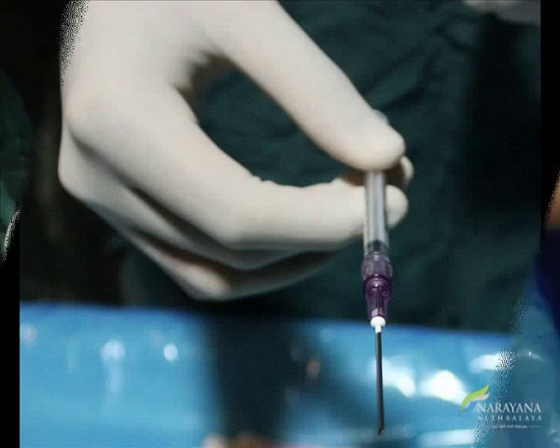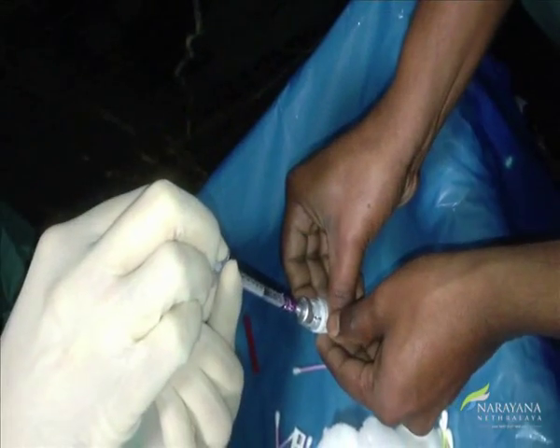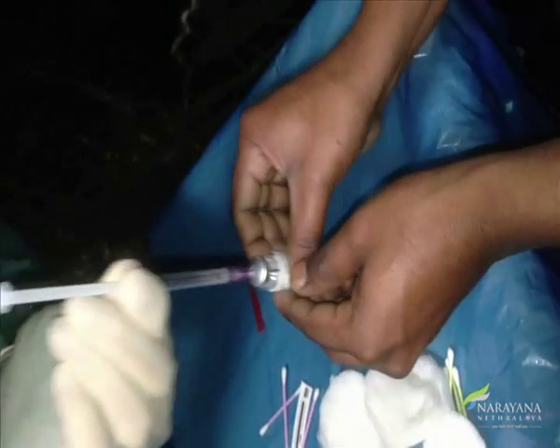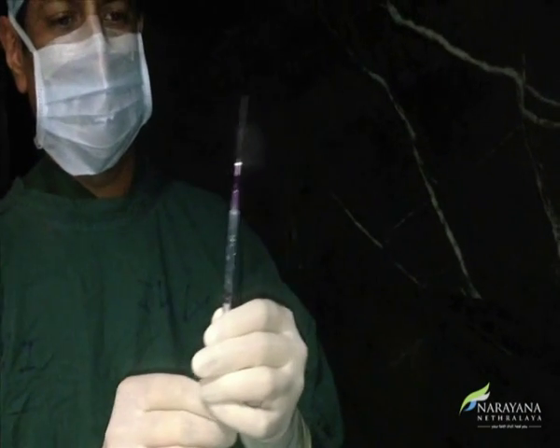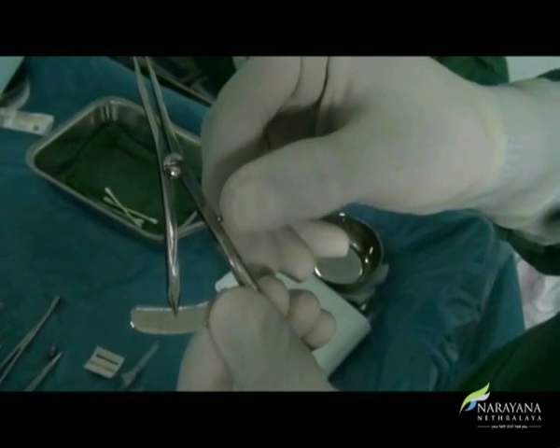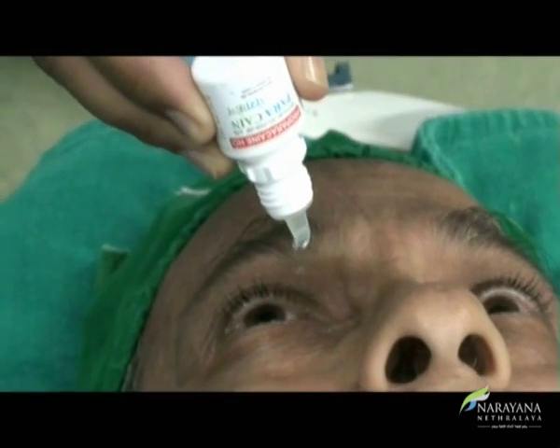In the case of Lucentis, a large-pore needle provided with the vial is placed on the syringe and the drug is aspirated, keeping the needle vertically down as shown here. The caliper is adjusted at 3 mm for aphakic and pseudophakic eyes and 4 mm for phakic eyes.